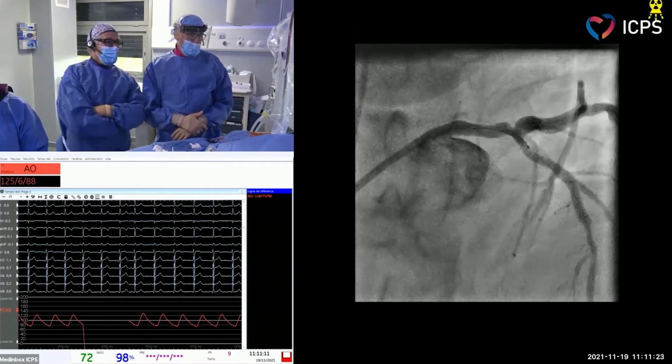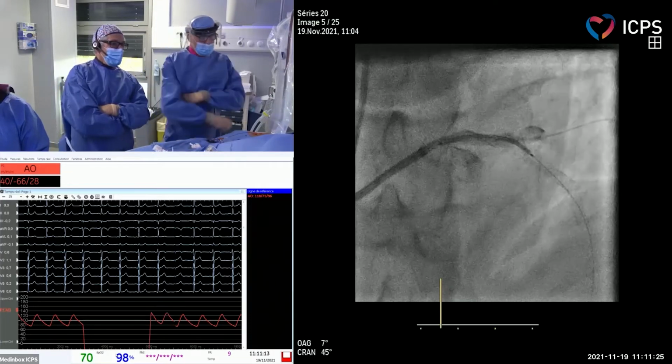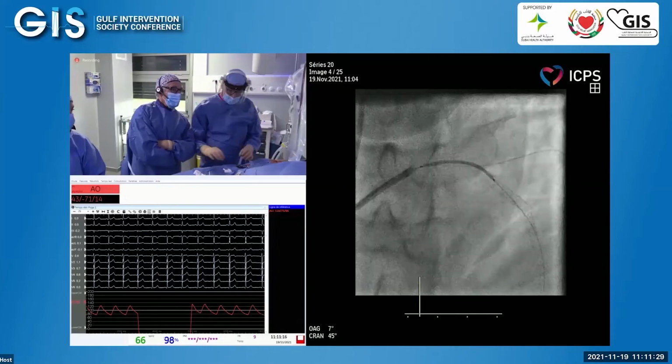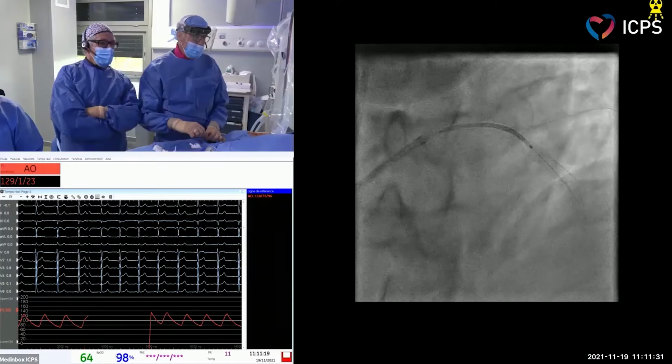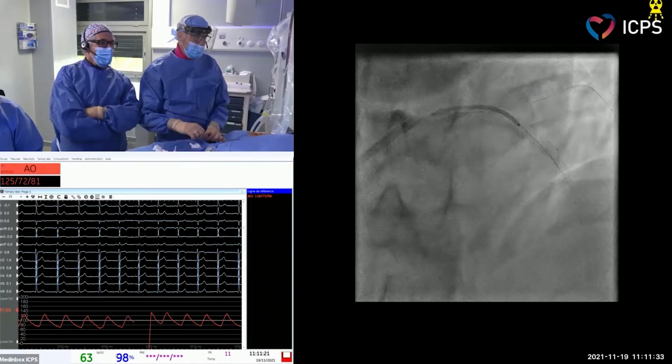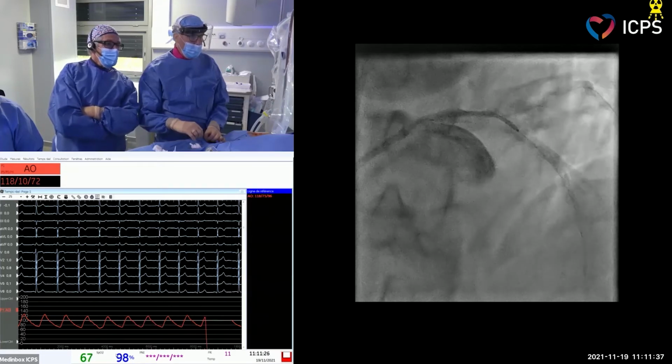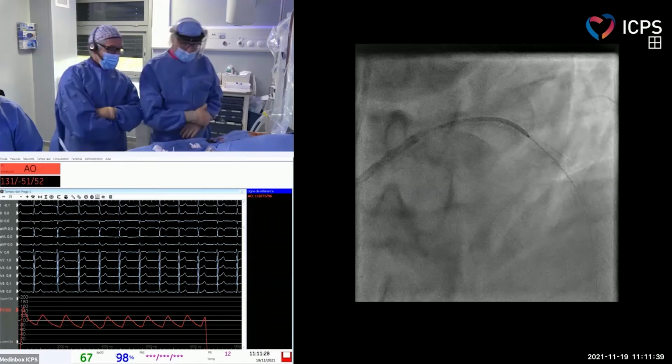And you see that maybe you can push 1 or 2 millimeters if you want to. You have overlap? Yes, we have a small overlap. Overlap, not too much. It's enough. Okay, for me, it's perfect. You agree? Okay.